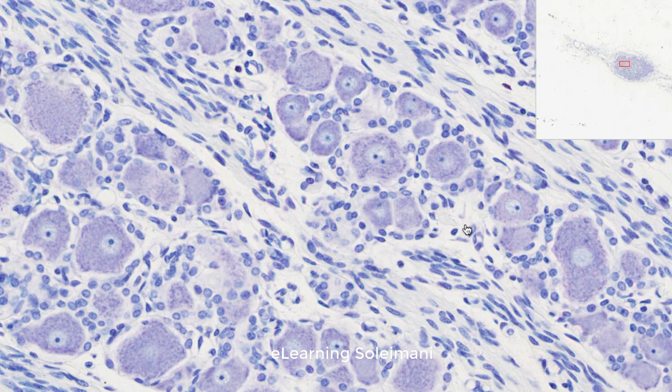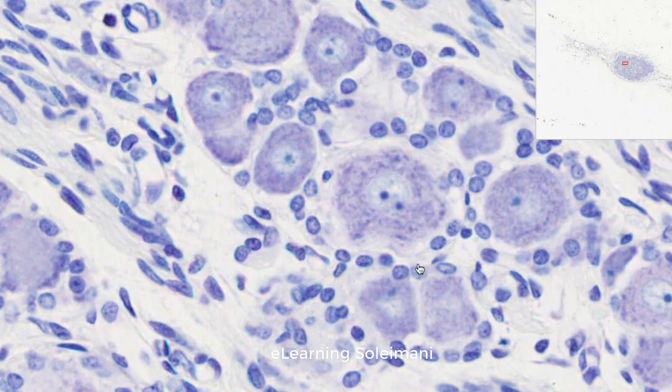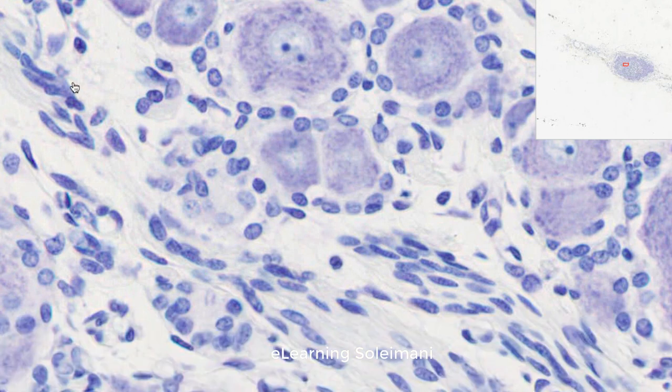Compared to spinal ganglia, autonomic ganglia contain smaller ganglion cells. These stellate-shaped cells possess synapses and have eccentrically located nuclei. They are also surrounded by irregularly shaped satellite cells which are sparsely distributed.